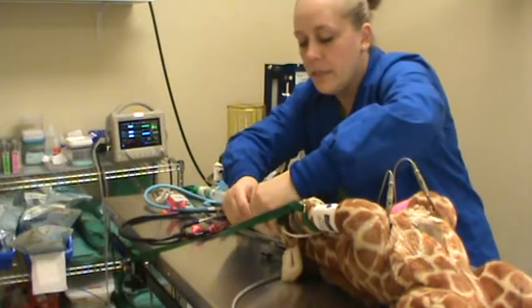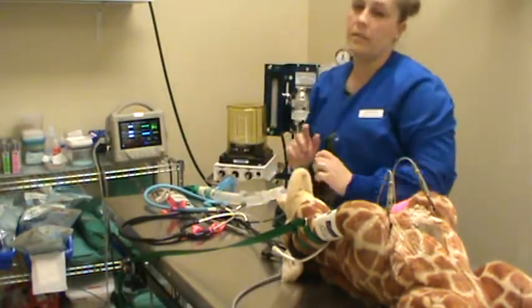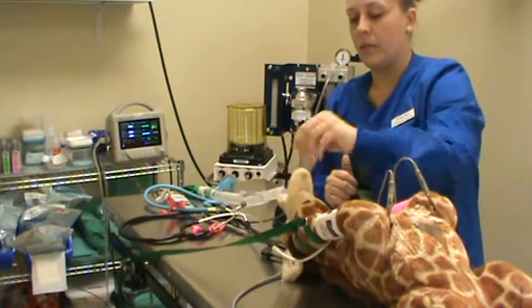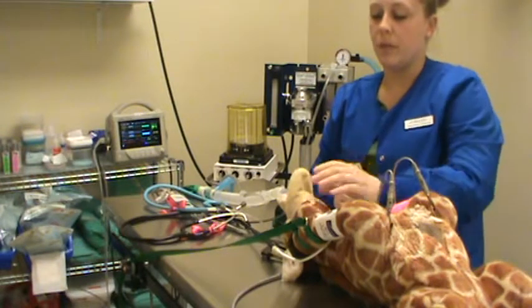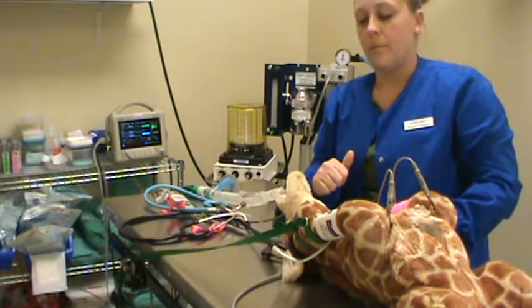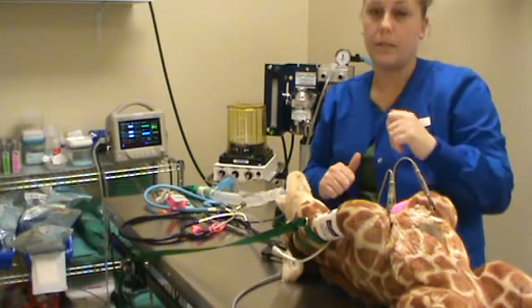So blood pressure, like I said, is down here on the monitor, the red area. So you get systolic, diastolic, and mean arterial pressure. Mean arterial pressure is really important to organ perfusion. So if the blood pressure is too low, the mean arterial pressure is going to also be too low. If it's below 60, it means your organs are not getting perfused with blood.